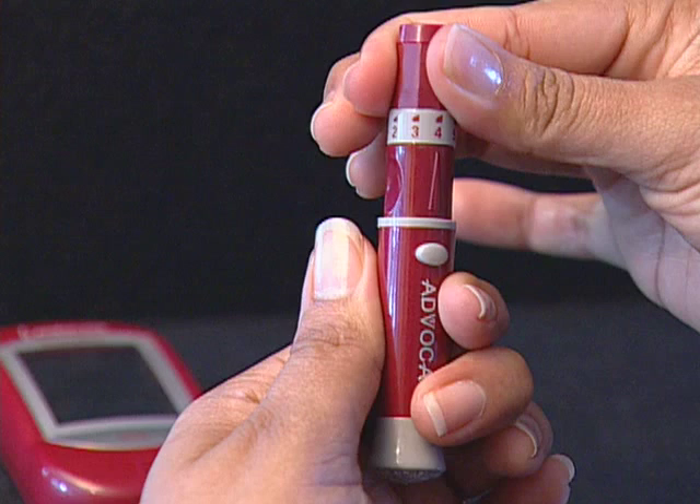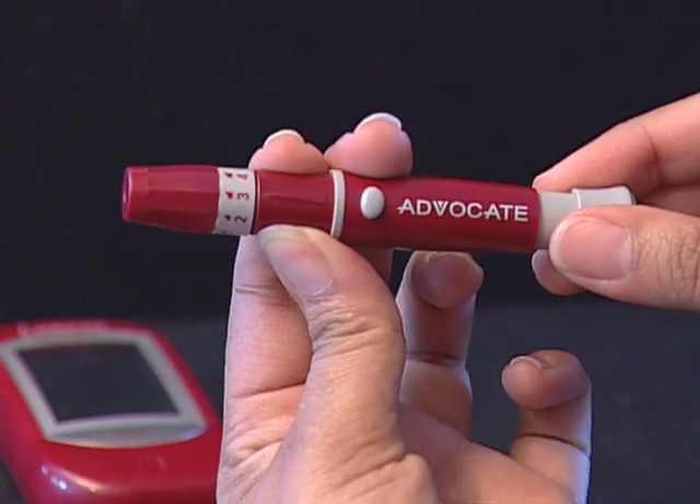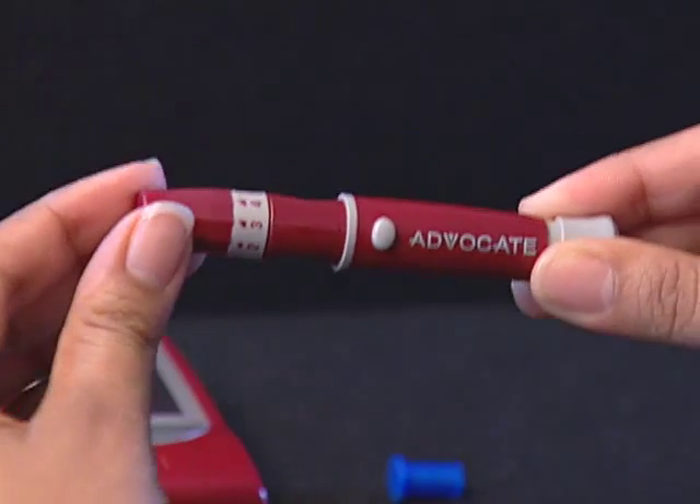Slide the ejection cocking control back until it clicks. If it does not click, the device may have been cocked when the lancet was inserted. The lancing device is now ready. Set it aside for later use.